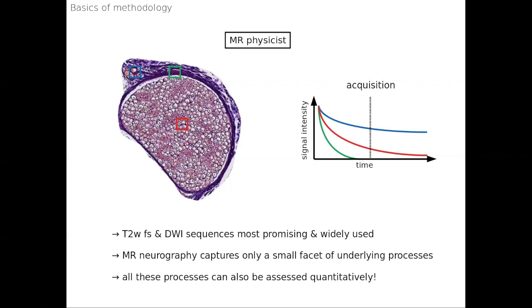Because we still don't know too much of the imaging and the signal behavior of the different pathologies, because of the quite recent technique, or the expanding use of MR-neurography, we still don't really know which parameters we need to use for what type of disease.